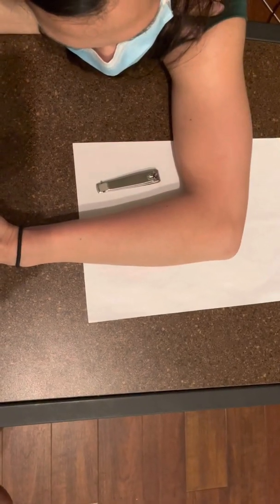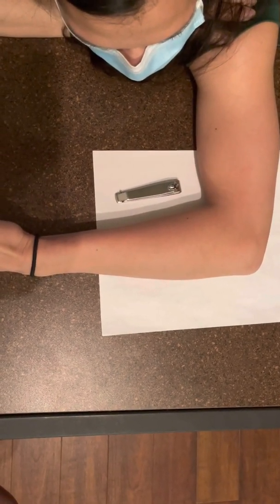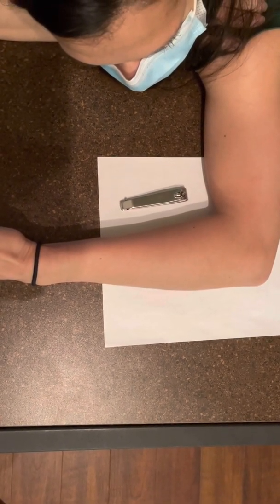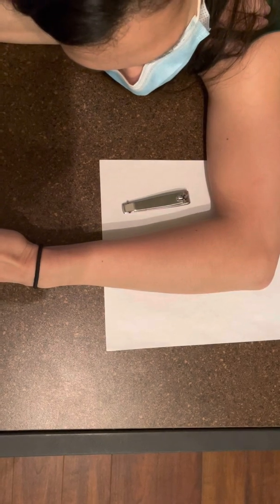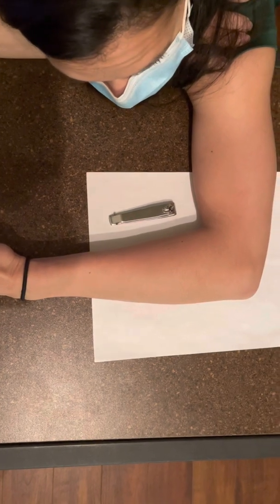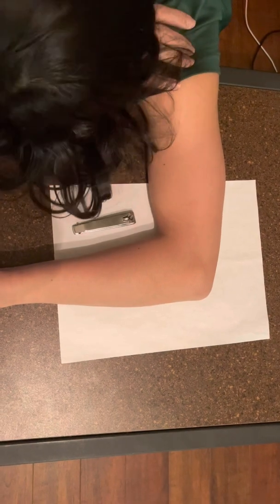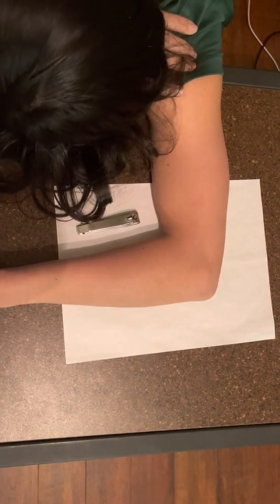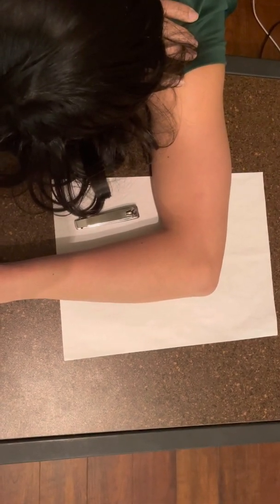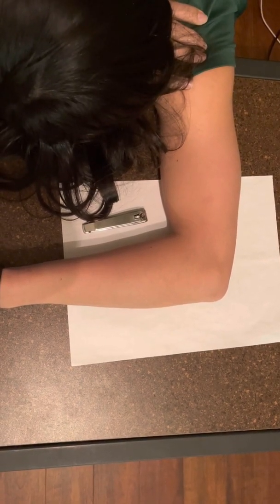For the lateral elbow, the patient is seated with the elbow flexed 90 degrees. The shoulder is dropped in order to maintain a parallel relationship between the plane of the film and the humerus and forearm. The forearm at the wrist is lateral. This should place a line through the humeral epicondyles perpendicular to the film. The central ray is directed perpendicular to the midpoint of the elbow joint through the center of the film space. Anatomy demonstrated is the distal humerus, proximal forearm, and olecranon process. Fat pads should be visualized.